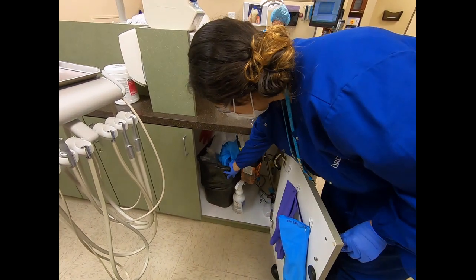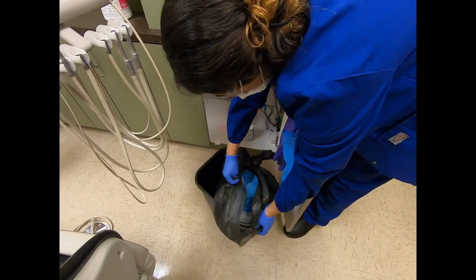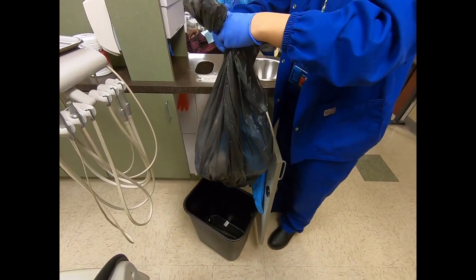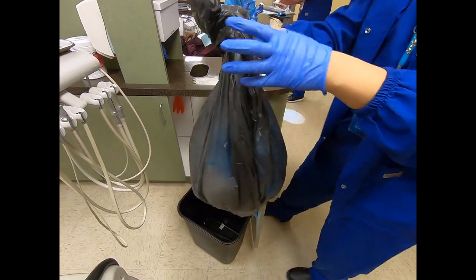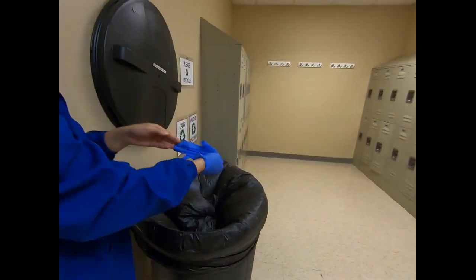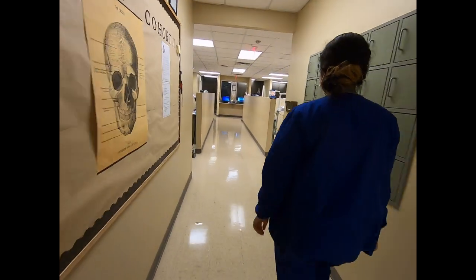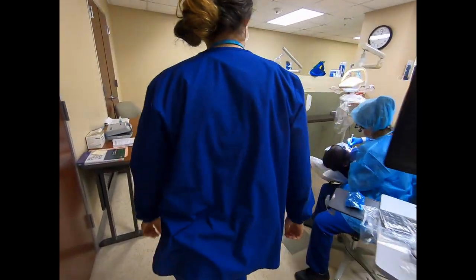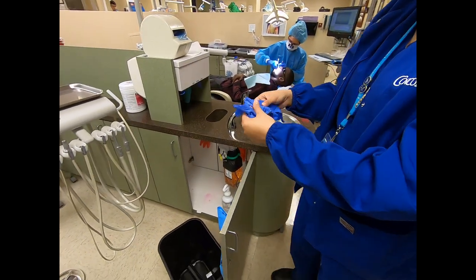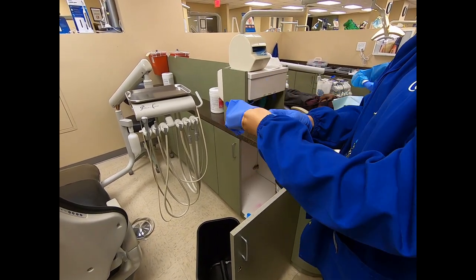Collect and secure your operatory trash and take to the designated area. Dispose of your gloves in this trash can. Return to your unit and place on a new pair of gloves and replace the trash can liner. Place the trash can under the sink and dispose of your treatment gloves.